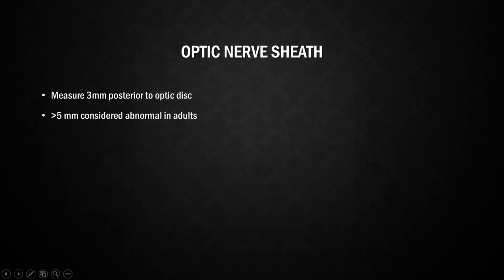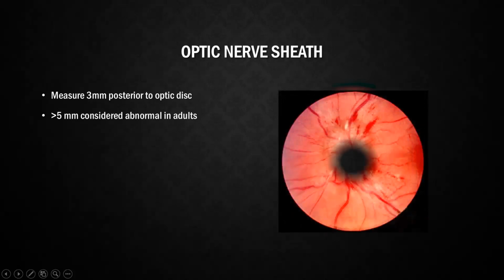Okay, so let's talk a little bit about the optic nerve sheath. When is the last time that you did a fundoscopic exam and you saw this? For me, I don't know, maybe when I was on my ophthalmology rotation in residency and the patients were dilated, but in the ER, probably most of the time I'm not seeing this. And I would imagine that that's true for most of you. Now, if you're an ophthalmologist watching this, then maybe 5 minutes ago you saw this, but for the rest of us, that's probably not the case.